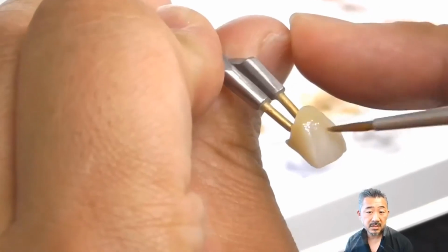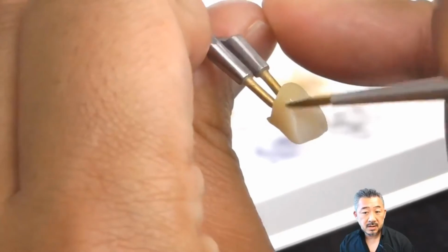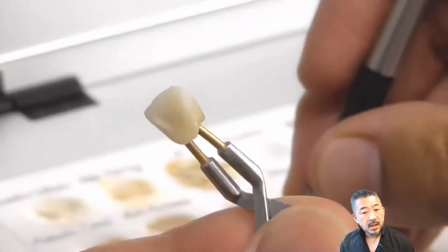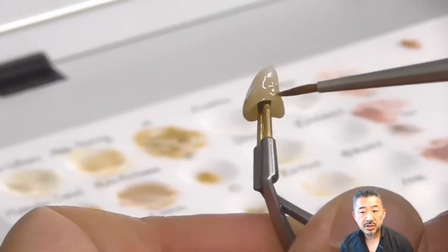So spread it thinly towards the incisor, but don't worry about the labial side. But do it on the mesial and the distal side as well. On the palatal side, apply a little wider on the inside of the marginal ridge.